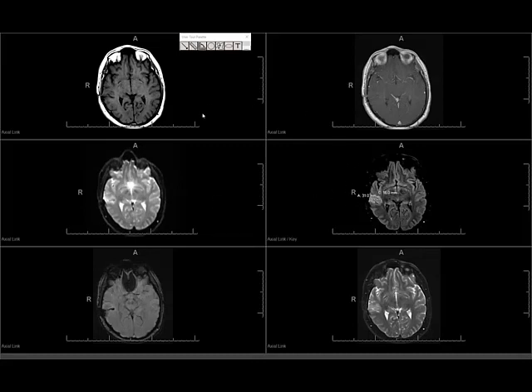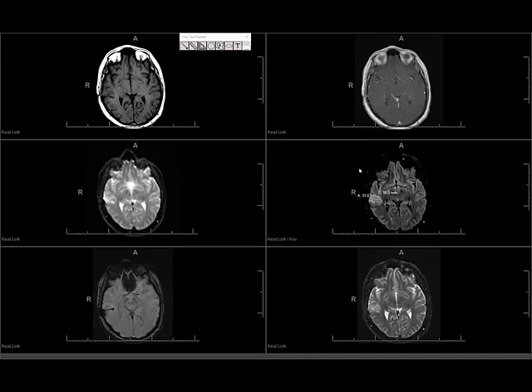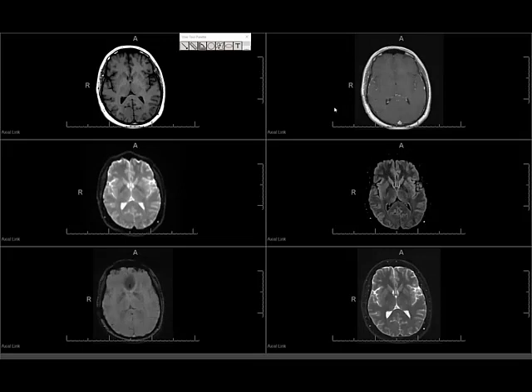I usually look at six sequences on one screen. Some attendings like to do one series per screen, some like side-by-side with two series, some like four, but I usually like six, which helps me compare different sequences on the same screen. I link all the sequences, so when I move one sequence, the others move as well.